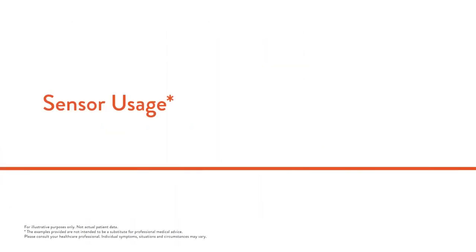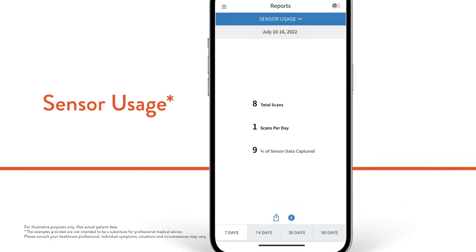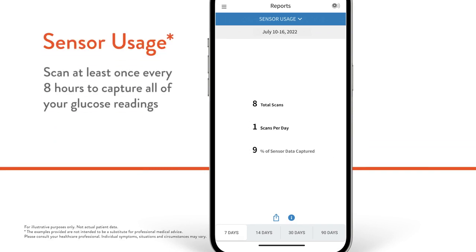The sensor usage report shows you how much of your glucose data was captured. You'll see your total number of scans, an average of how many times you scanned your sensor each day, and the percentage of possible sensor data captured from your scans.